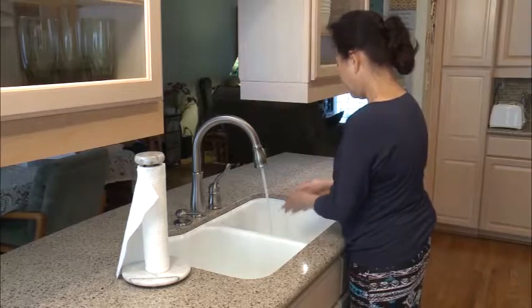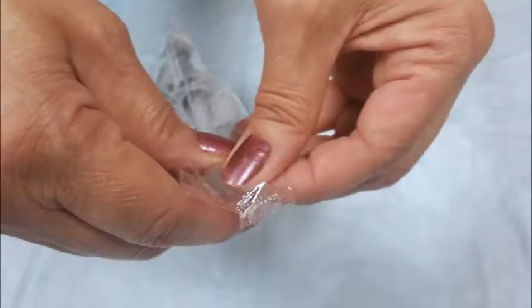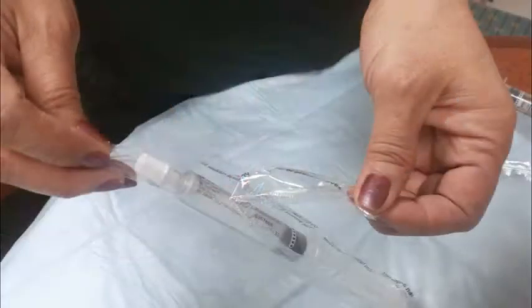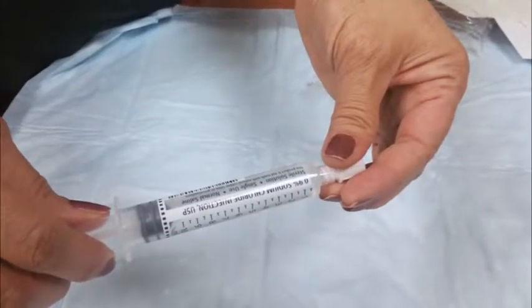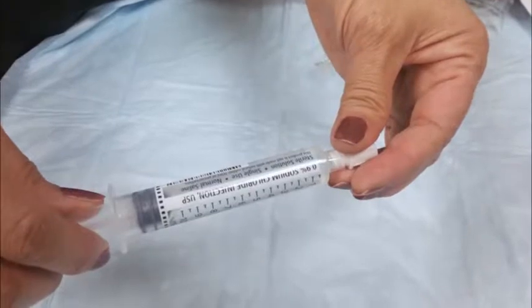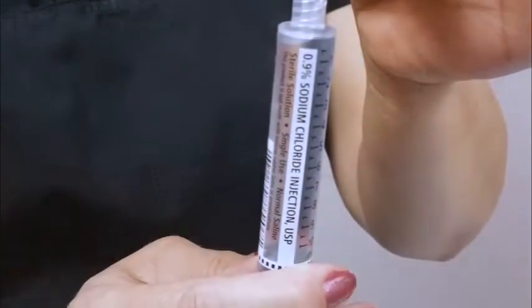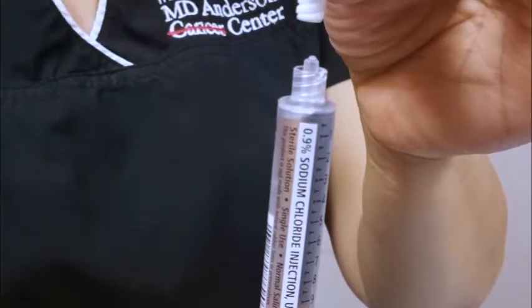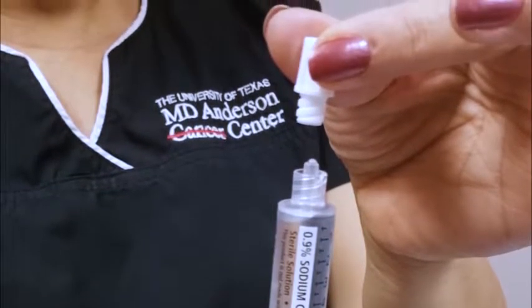Wash your hands for 15 seconds. Gather the flush and antiseptic pads. Open the syringe package. Check the label to make sure you have both the right drug and the right dosage. Check the expiration date. Hold the syringe point straight up. Remove the protective cover and pull down on the plunger.